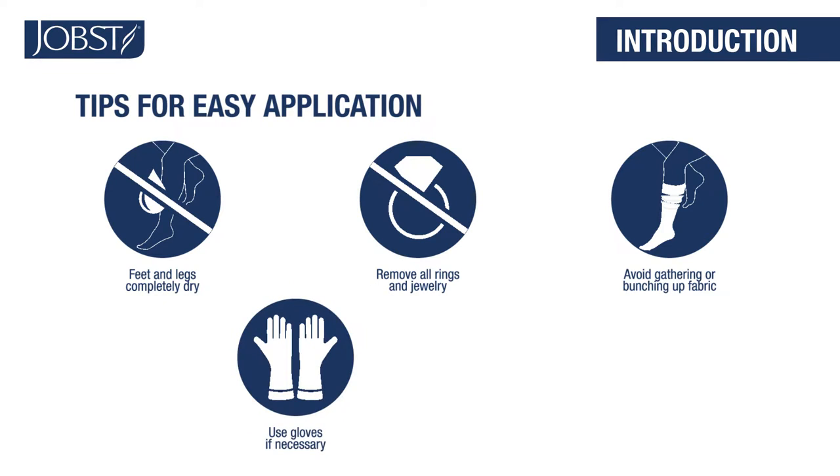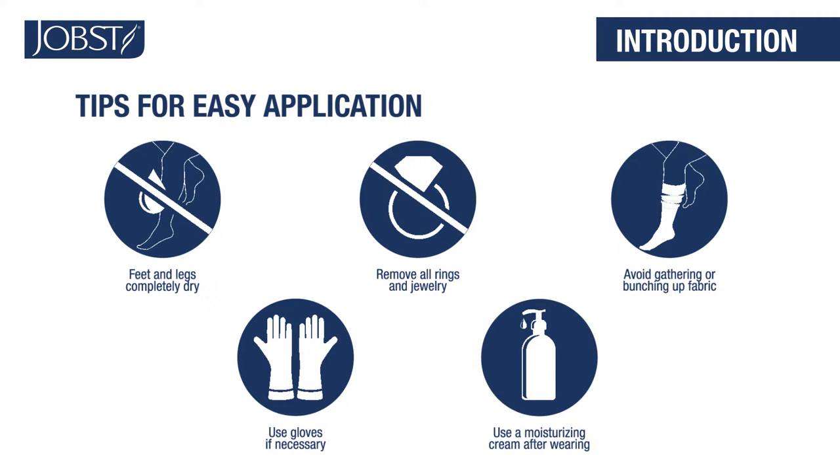If you prefer, you can use gloves to help create friction and provide a better grip. Use a moisturizing cream after you take off your Jopst hosiery to keep skin moisturized and healthy.